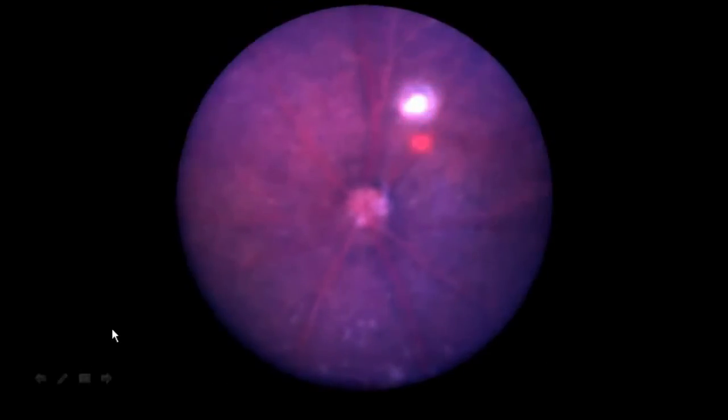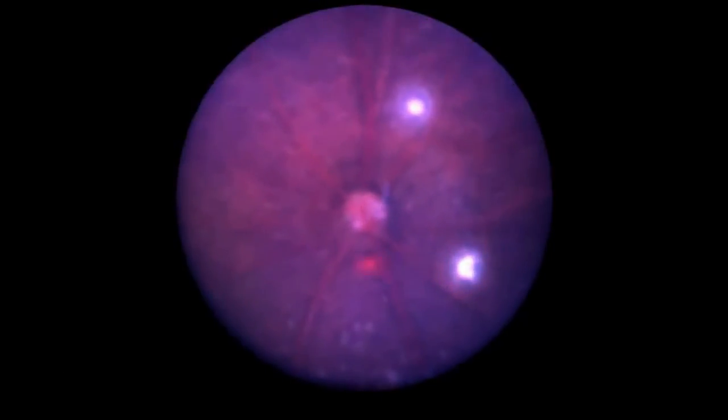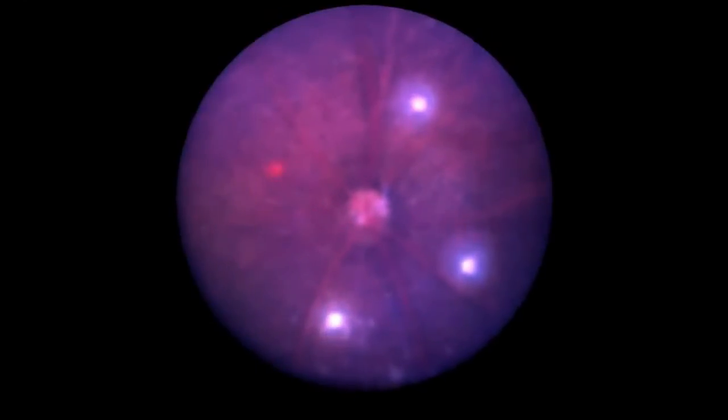This video will show you how the vaporization bubbles look. The bubbles will arise immediately after laser shot. It will expand and then shrink quickly. After that, you can see a halo around the laser burn and a bright spot in the center.